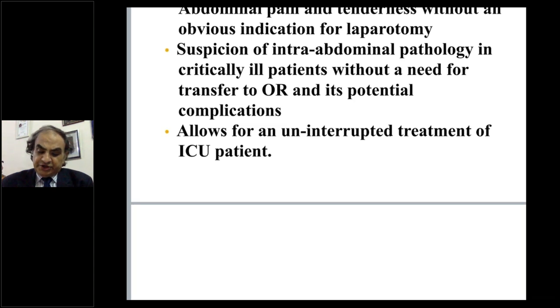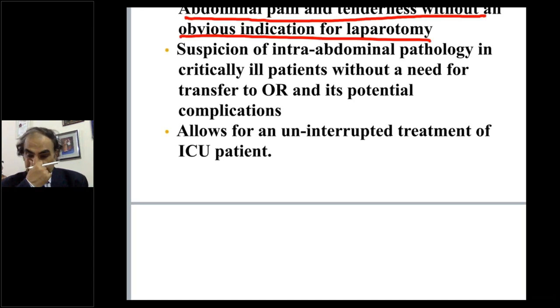Now, any situation where the patient has abdominal pain and tenderness, but no indication for laparotomy. So, what have I done here? Short of laparotomy. There's a lot of collection inside. You've tried your pigtails. It is not draining out. So it can be a good peritoneal lavage, washing, and placing a drain appropriately and of appropriate size where you want to put it. So it has a role.